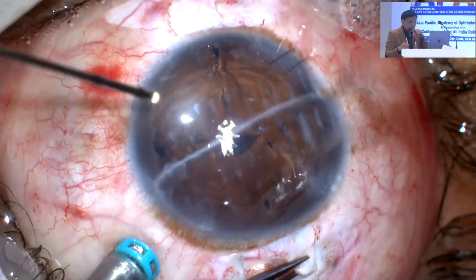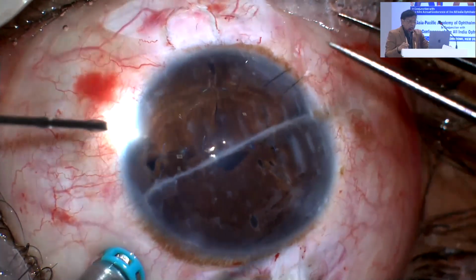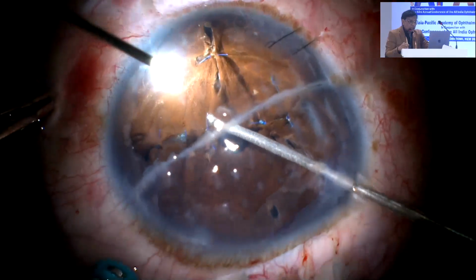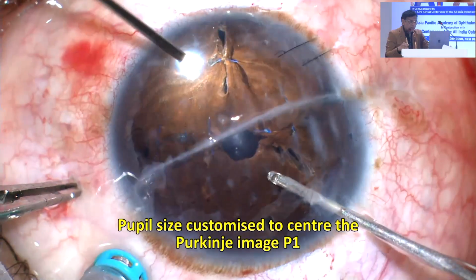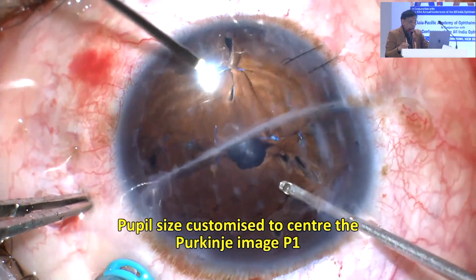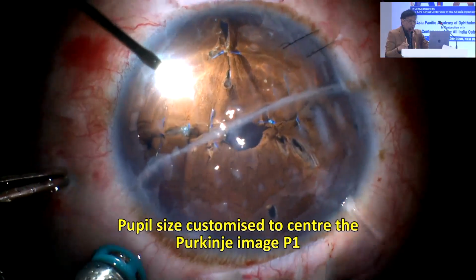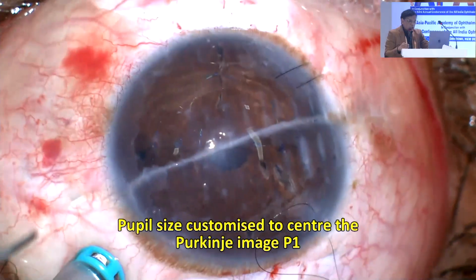Once that's done, now look what I'm going to do. I'm going to check the haptics. Once the haptics are in place, then take the vitrectomy probe. And you can see there, with the vitrectomy probe, decide and see whether you need to make that pupil correct size or not. It has to be centered around the Purkinje image, and you can see it's approximately in the Purkinje image there. Once that's done, I now close this patient down.